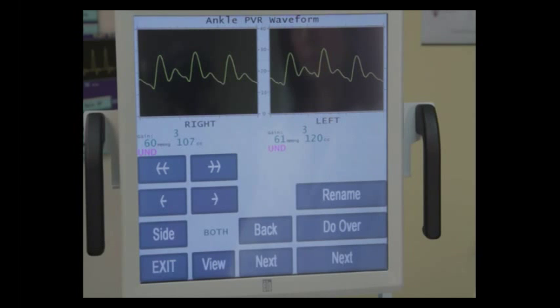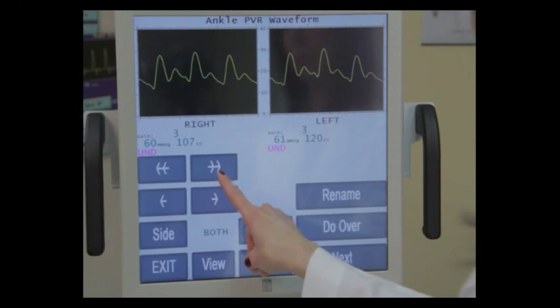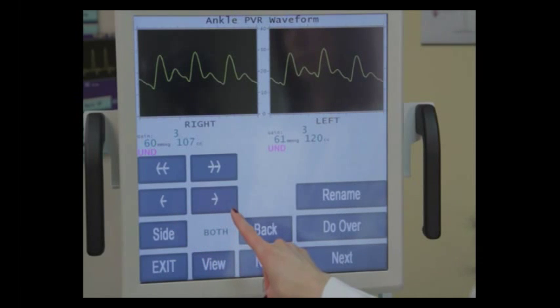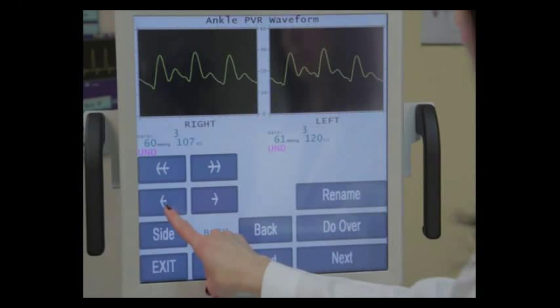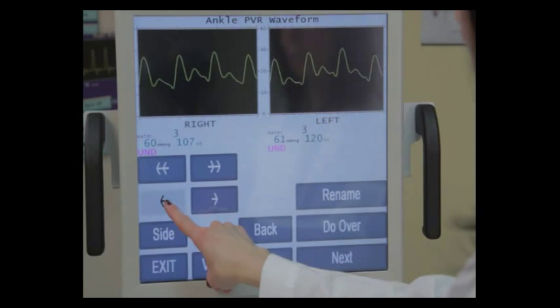Now I'm going to describe on this screen how we can manipulate this information. Sometimes a patient will have a tremor in one leg, and the PVR on one side might be artifactually affected and the other one might be fine. So there are scroll buttons at the top of the screen. The double arrow is for fast scroll back and forth, and the single arrow is for slow scrolling back and forth. And I'm going to slow scroll both waveforms to the left. Notice how slowly they scroll.